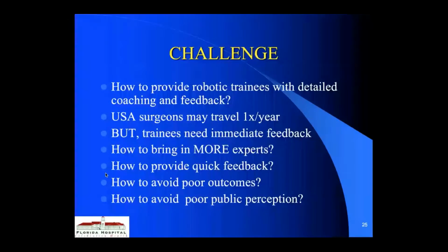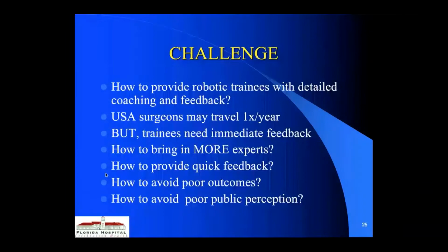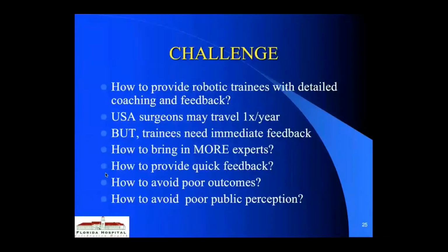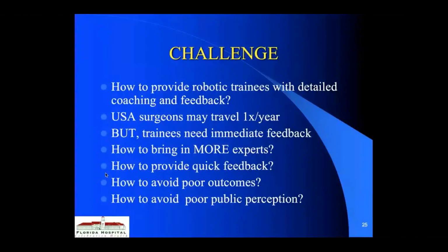And these are just some of the challenges that we talk about every day. Certainly in quality assurance, we're talking about poor outcomes. How do we take someone that has had, say, 5 leaks, bowel leaks? We videotape them, and then we would put them on a simulator and see if we can identify where the strengths and weaknesses of this person are. Is it the surgeon themselves? Is it a team challenge? And then we can correct that.